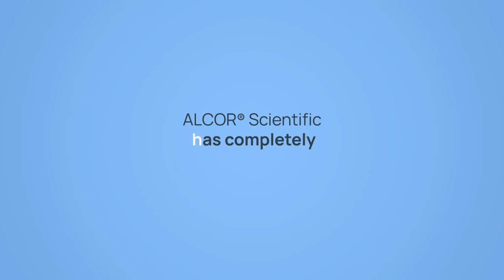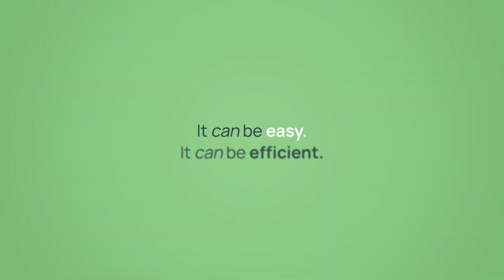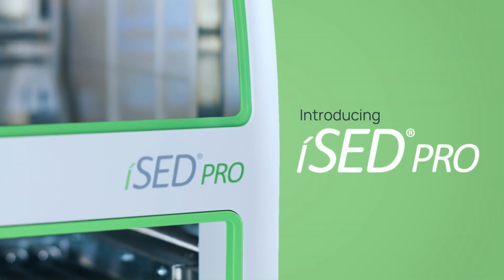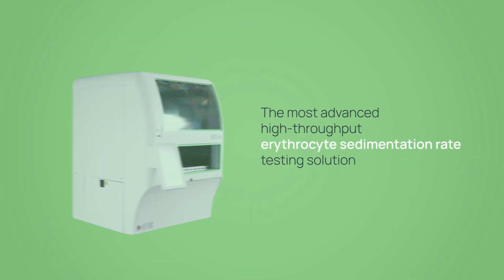Alcor Scientific has completely reimagined ESR testing. It can be easy. It can be efficient. Introducing iSED PRO, the most advanced high-throughput erythrocyte sedimentation rate testing solution.